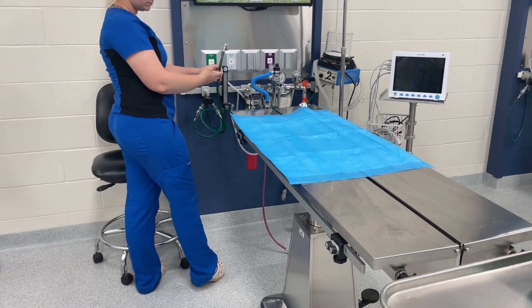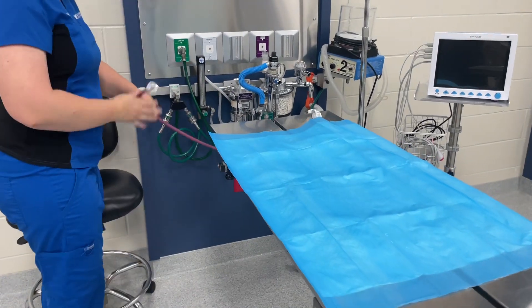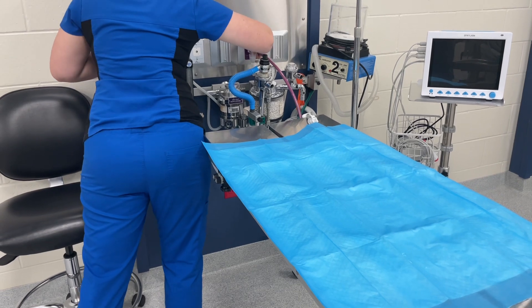Make sure you also hook up your oxygen hose and your waste gas hose, and you're also going to make sure that you pressure check your machine.